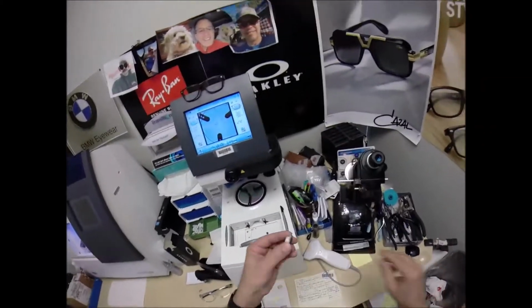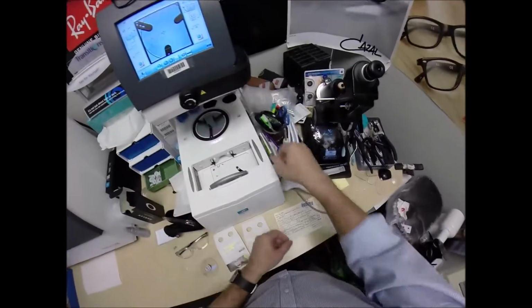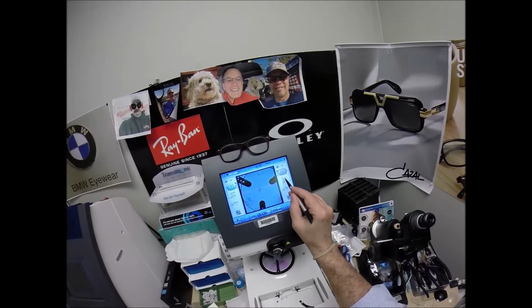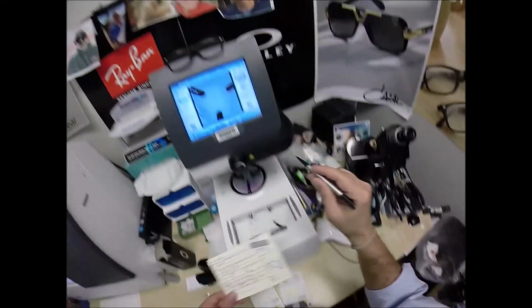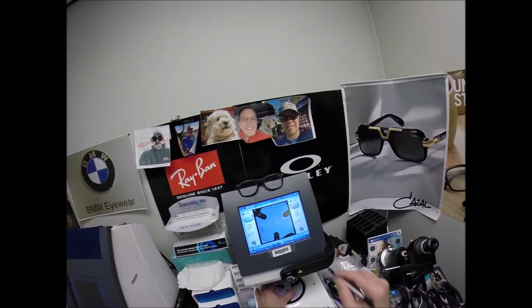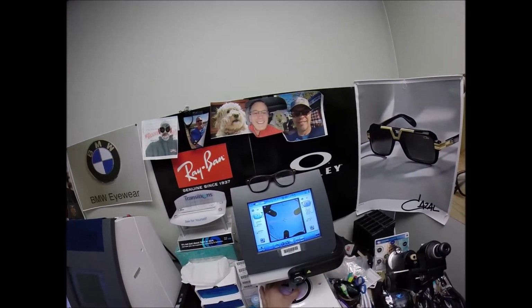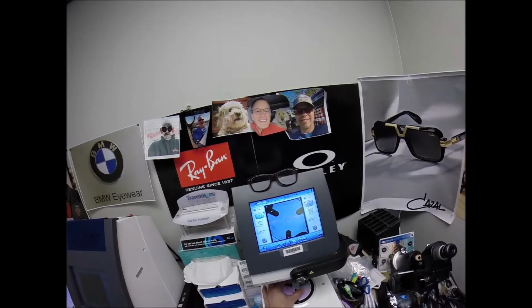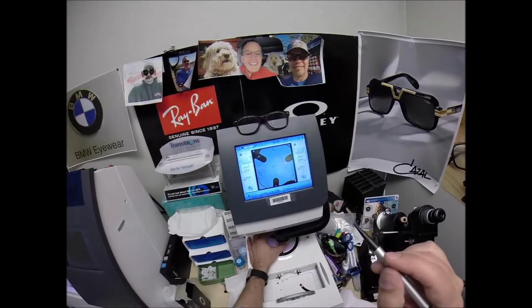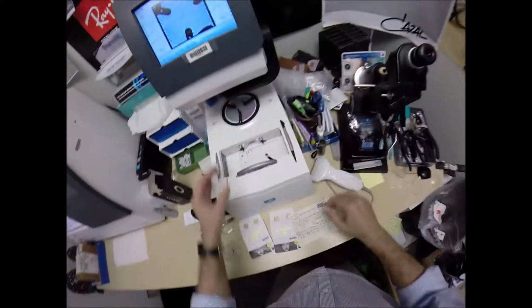Pull the paper away to make the black side sticky. Line up the magnet. Your pupillary distance for your left eye is the same as the right, so I don't have to do anything. The left lens has mirrored the right. Same optical center height of 22. Get everything lined up in there just perfectly. Make sure the lens is large enough to fit, and it is. Hit that button. The arm comes down, places the block onto the left lens.